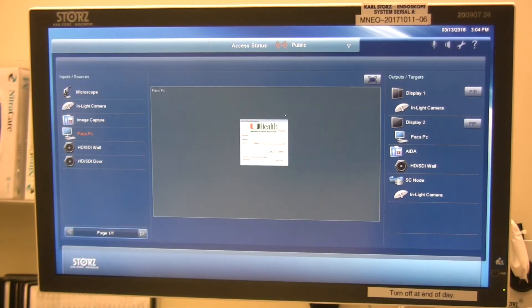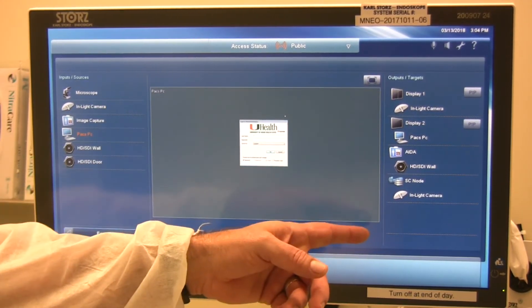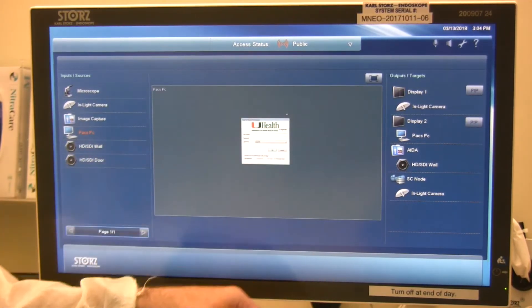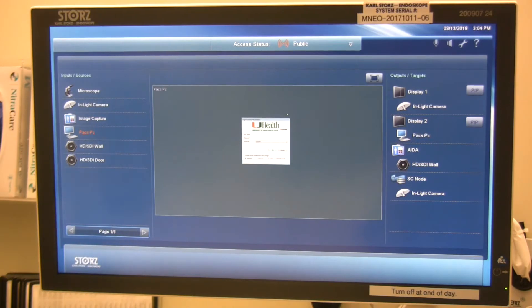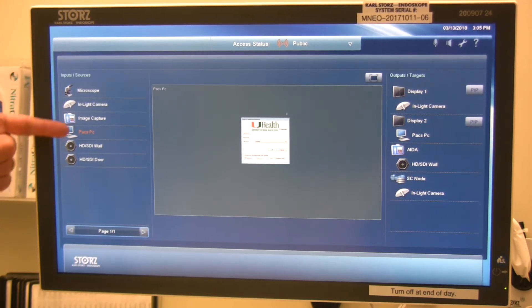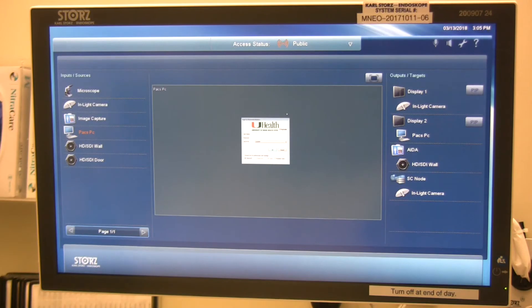Now we're going to take a closer look at the outputs in each room. The outputs are the destination tabs on the right-hand side of the preview screen. On the top, you'll see Display 1 or Procedural Display — that is the display above the AIDA image capture device by the main doorway in each OR. Below that is Display 2, which is on the wall opposite Display 1. The AIDA HD Connect is our recording device, located below Display 1. When recording, select the video source you want to record, get a preview of it, and route it to the AIDA to capture that video source.